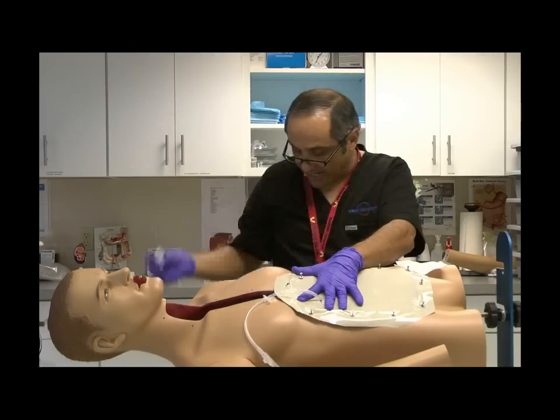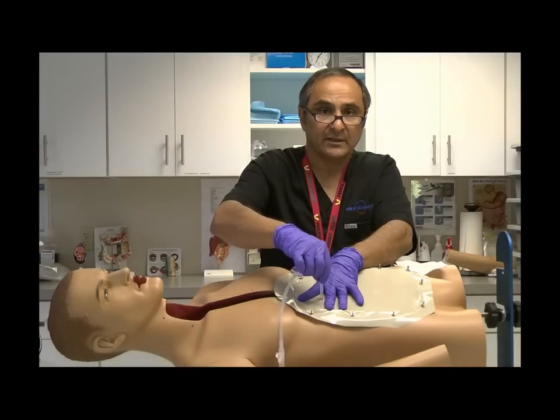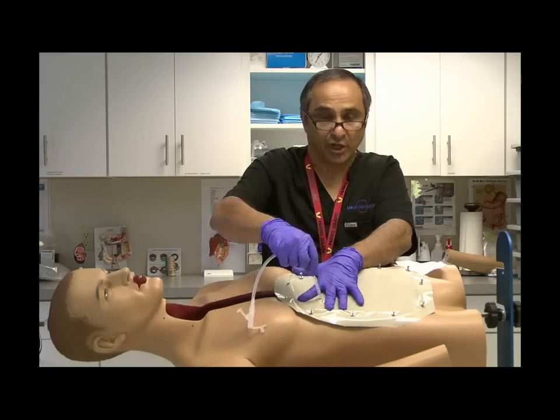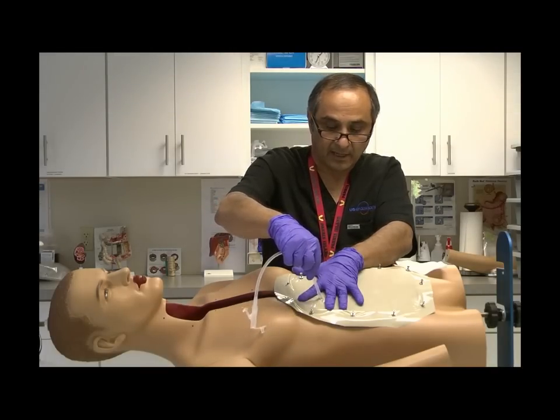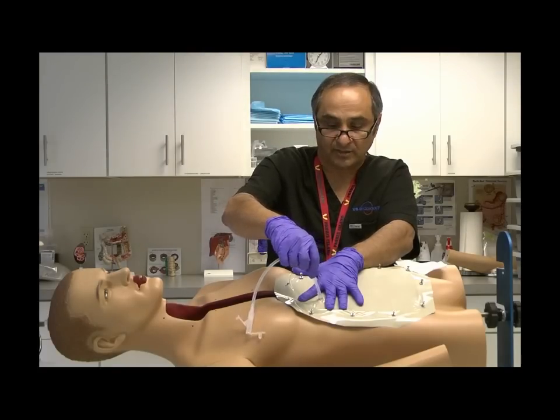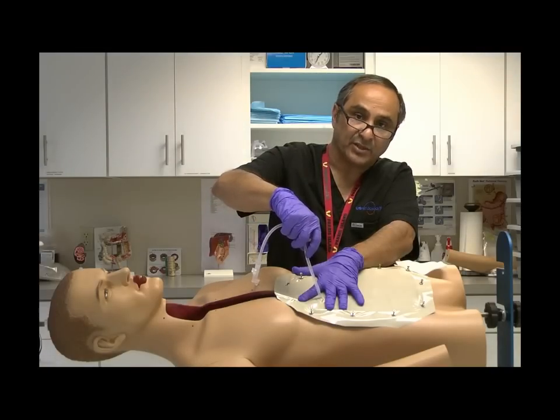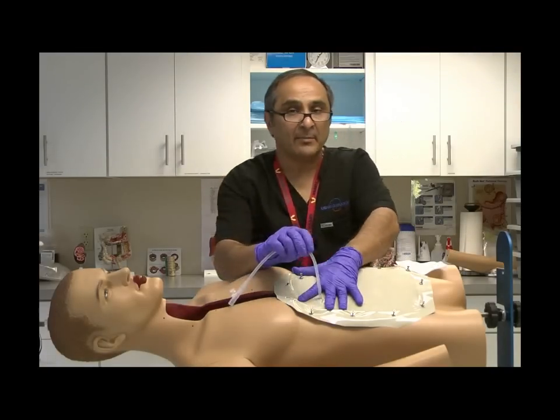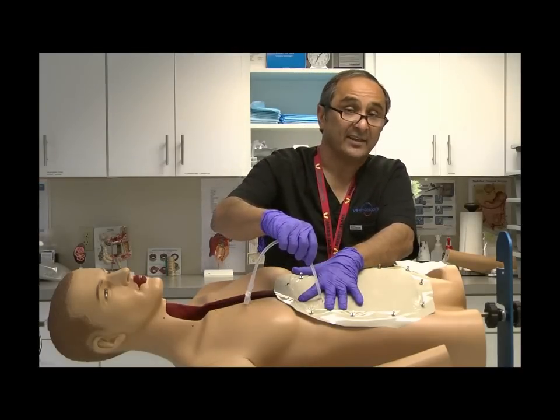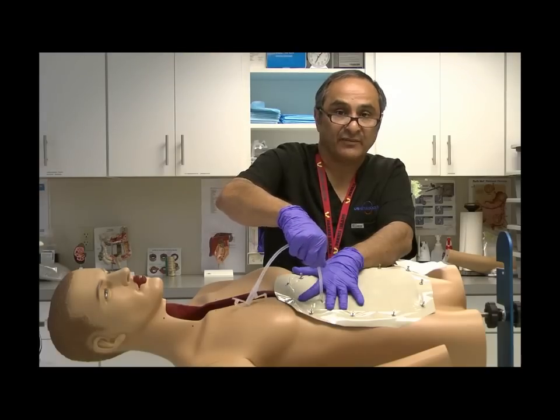Set the obturator aside, and then gently tug on the device to assess that it's secure. On this device, I have 1 centimeter of device inside the patient, and I can see that on the markings on the peg tube. And in an established peg site, you may not see any more than 2 or 3 centimeters of device inside the patient. The device rotates very easily.